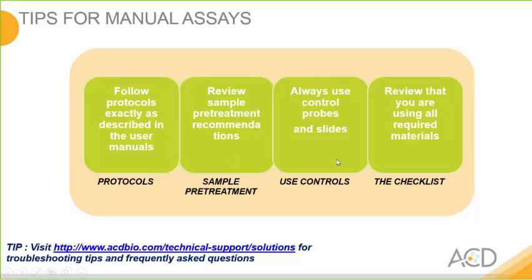And the third is to use controls with your tissues. And this serves as an assay workflow technique check, and also to confirm RNA quality in your sample before you proceed with the target probes. And then also to review to make sure you have the required materials to ensure success.